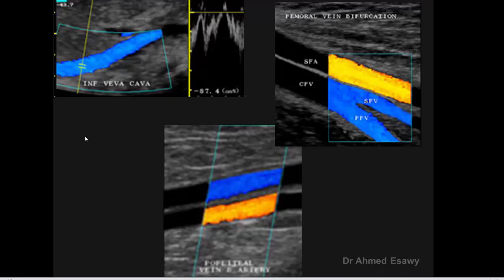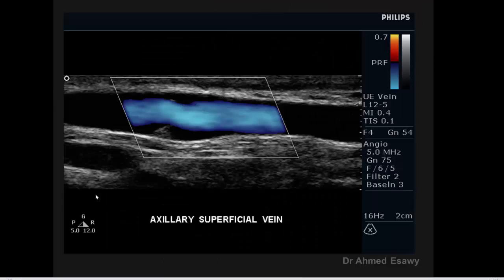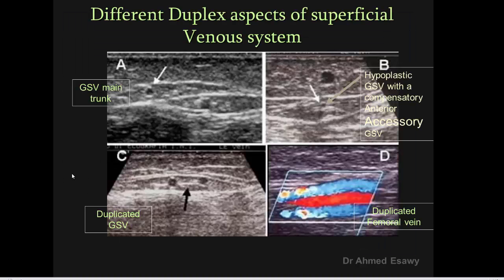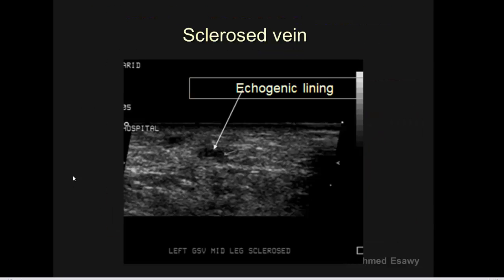This shows the inferior vena cava, superficial femoral vein, and profunda femoral vein with the superficial femoral artery — normal appearance. The great saphenous vein main trunk, with its normal Egyptian eye appearance in cross-section, may be hypoplastic with compensatory anterior accessory veins, or may be duplicated. Sclerosed echogenic lines of the great saphenous vein may also be seen.